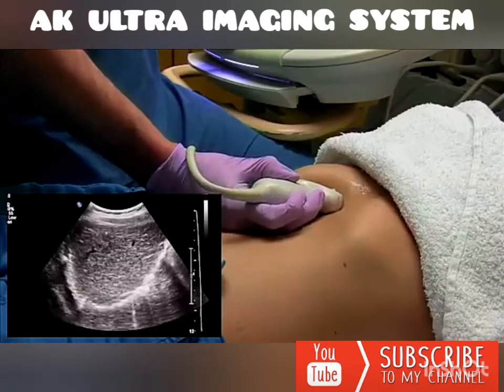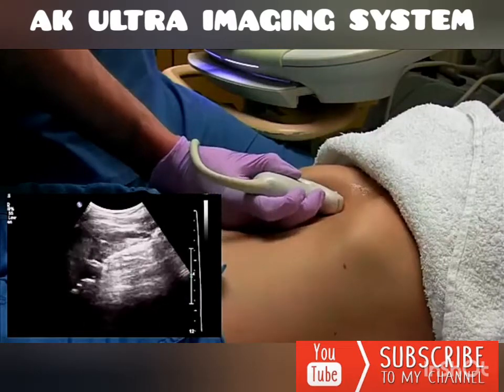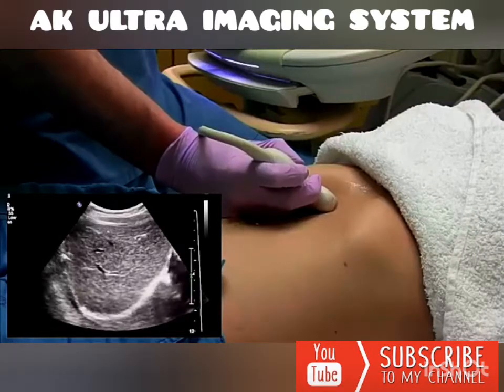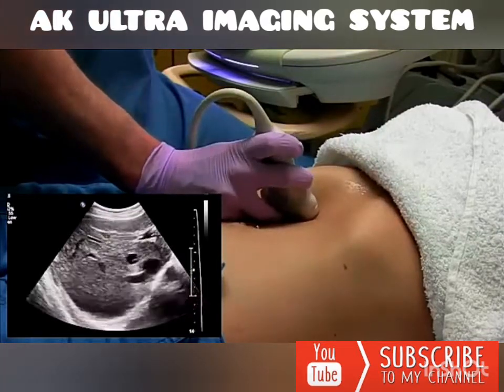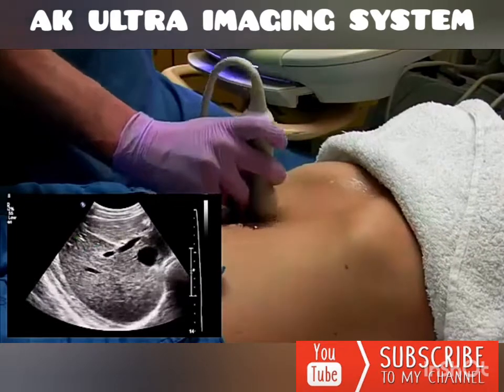So you angle all the way up through the dome of the right lobe and start to come down. You get the parenchyma. Coming down, you'll see the hepatic veins again, and then you'll also come into the portal. And from here we just sweep all the way out of the liver.